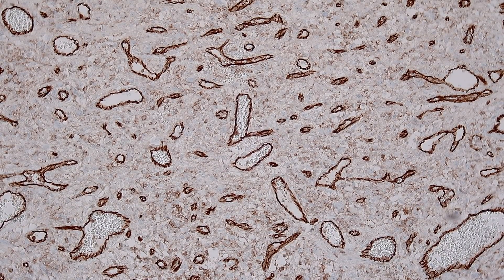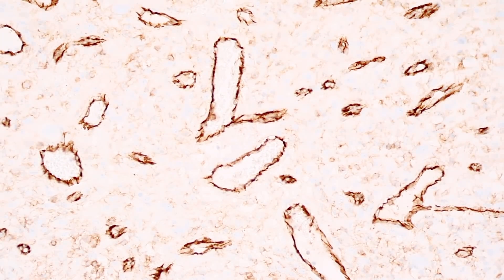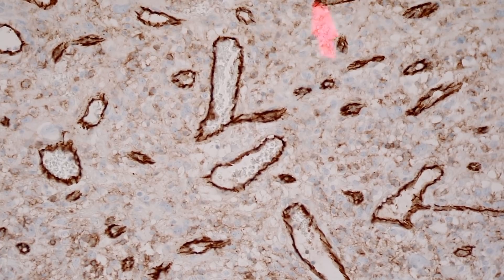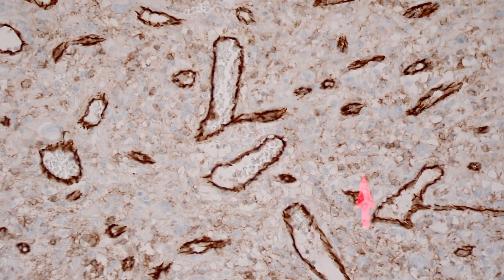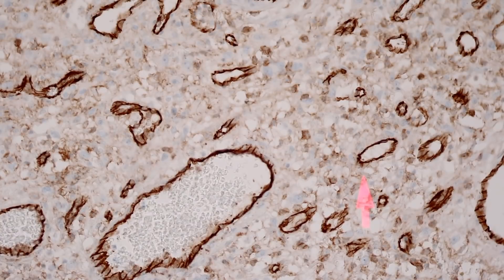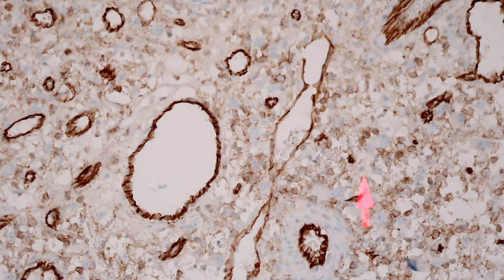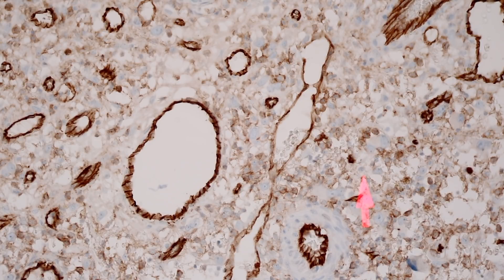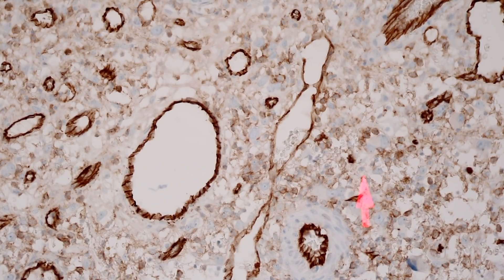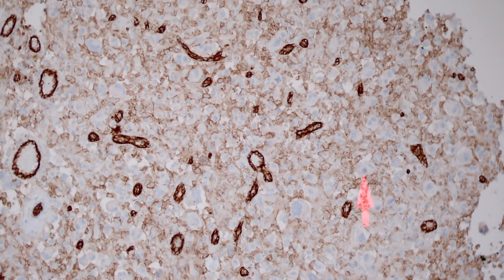In between there are tumor cells as well as histiocytes, and look at this — they have a weak, patchy, granular staining. This is normal in histiocytes. Histiocytes often stain with CD31 and it's usually this kind of granular, weak staining. The question is whether this vascular marker positivity is in tumor cells or just a nonspecific blush.